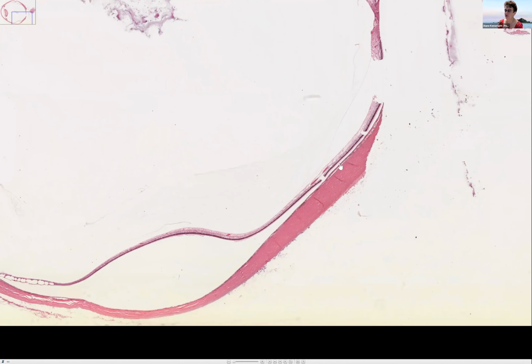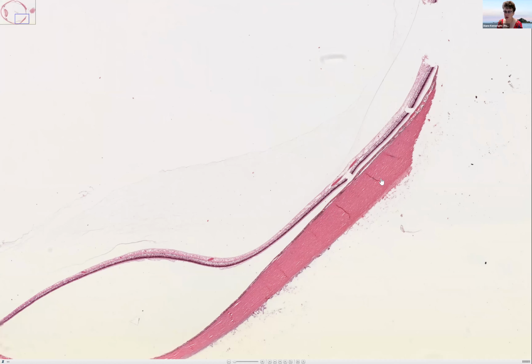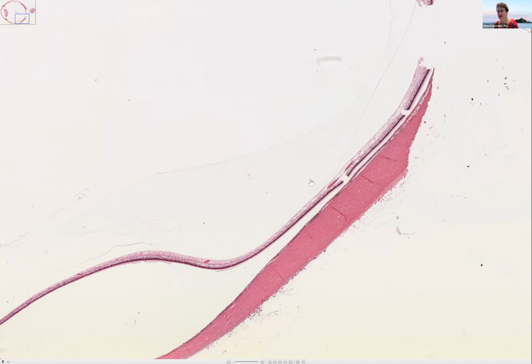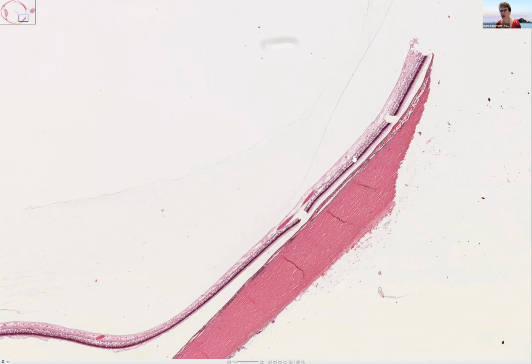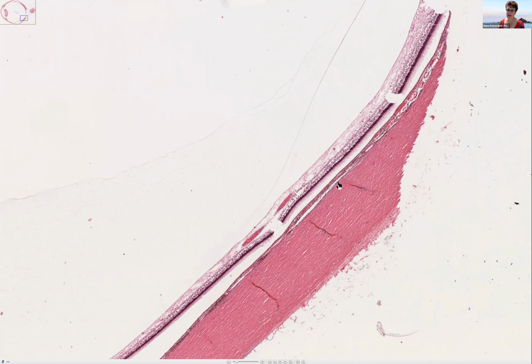Inflammatory infiltrate. So people are asking my herpetic question. That's right. A herpes infection would attract an inflammatory infiltrate. The acute retinal necrosis would be full thickness. Yes, it would be. And the other thing, of course, is the herpetic inclusions. So good answers there from everybody, including Nishan, who said yes, it will be full thickness, and there will be signs of inflammatory cells as well.